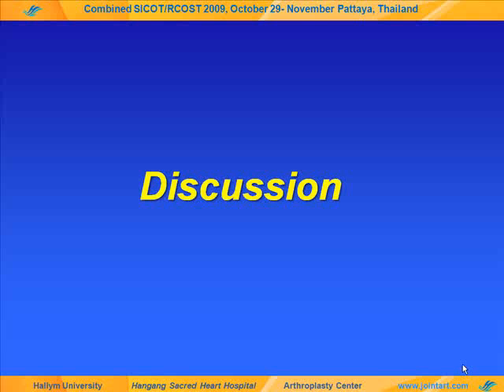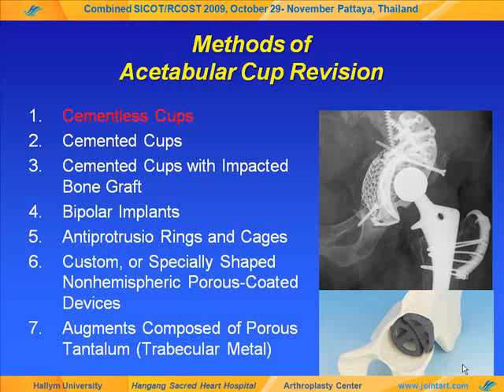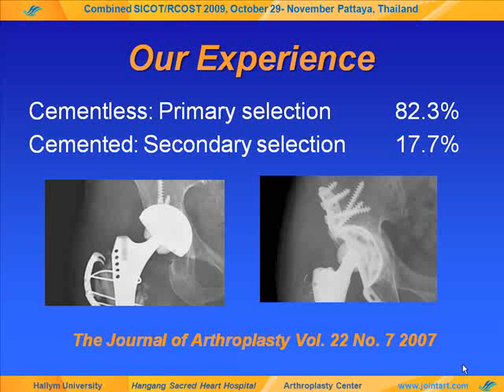Discussion. There are various methods of acetabular cup revision, including cementless cup. To use ceramic bearing, a cementless cup should be used. In our previous study, cementless cup could be used in 82.3%, not in all the cases. Therefore, more thorough pre-operative preparation should be made for revision total arthroplasty.